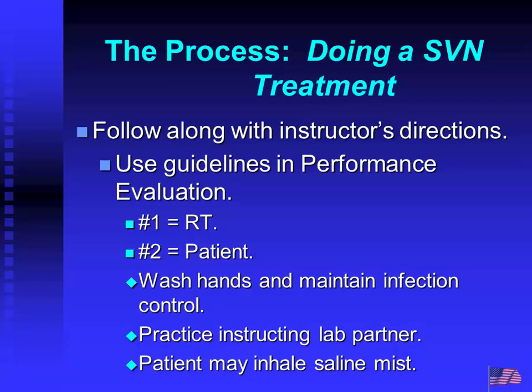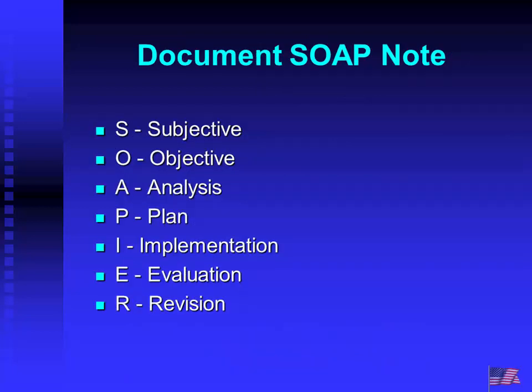There we go. All right, so today we're going to talk about doing a small volume nebulizer treatment and talk a little bit about metered dose inhalers. I'm not going to hold off doing anything today because for one, half of you aren't here, and for two, I like having Amber available so we can supervise better. But we'll talk about doing a therapy. When we actually do the performance evaluation, you'll be doing it on a mannequin or on one of us, but not on each other. But you'll want to practice doing this.